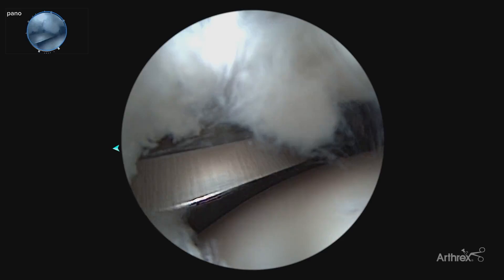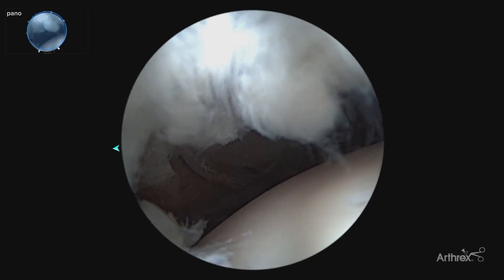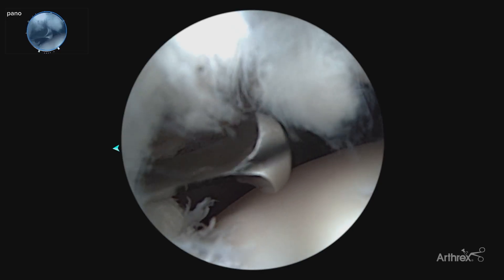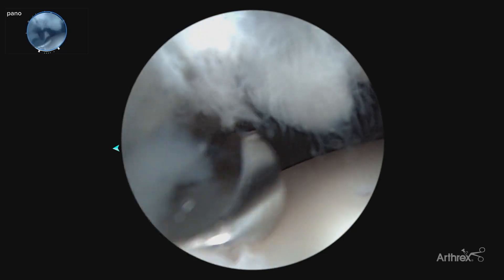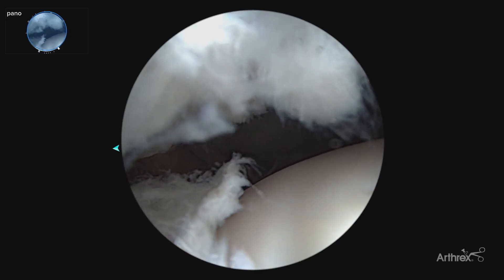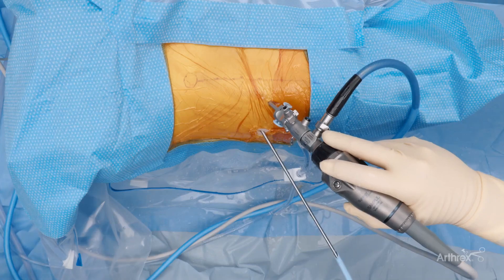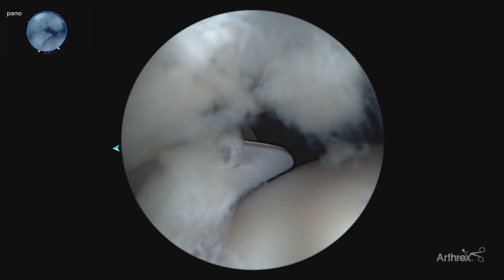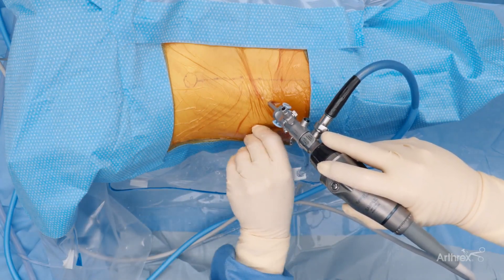Now we are ready to perform our interportal capsulotomy. We can make this as minimal or as extensive as we'd like. We are going to extend this, touch posterior lateral, and now back towards our mid-anterior portal to start our interportal capsulotomy. You'll notice that the blunt tip is protective throughout the capsulotomy cut. Here, if you take my Flush Fit cannula back, we'll switch now back to the mid-anterior portal to complete our interportal capsulotomy. I'll go ahead and take out our Safe Cut Capsulotomy Blade.